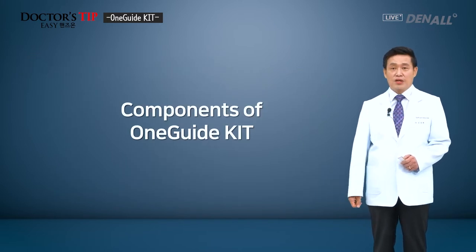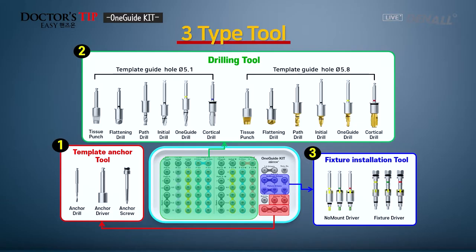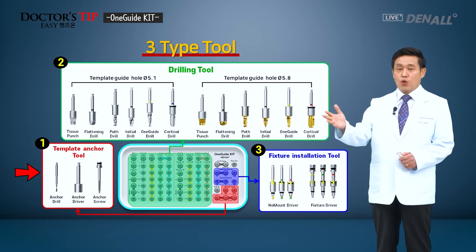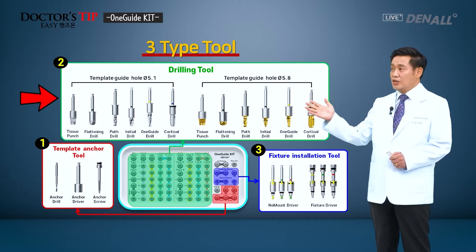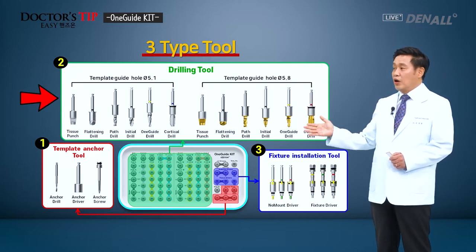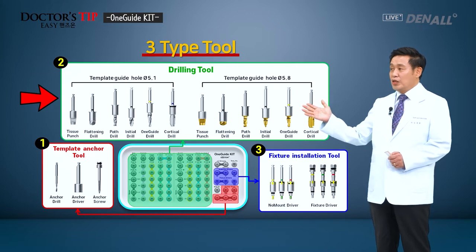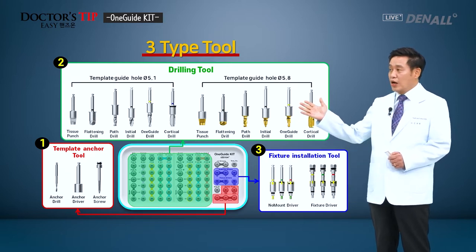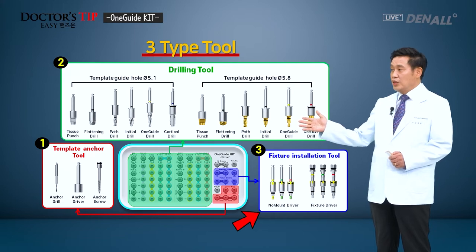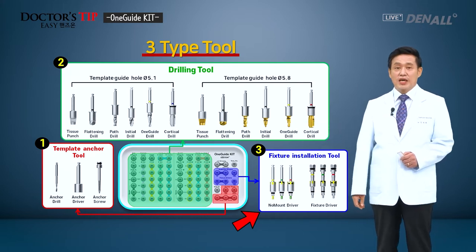Let's look at the OneGuide KIT components. There are largely three types of tools. The first is the template anchor tool. You can put the template in the wanted position and fix it using the anchor drill and anchor screw. The second is the drilling tool, basically using the OneGuide system to place an implant. It's a system to do drilling for that. The third is the implant placement tool: you create the drill hole, and then using the tool, you can place the fixture yourself. These are the three tools available.